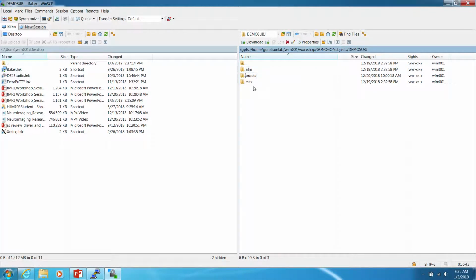Yeah, so just for a little bit more cloud level, with fMRI, the signal to noise is pretty small. So what you have to do is have lots and lots of events in order to filter out what is noise from what is signal. So with fMRI studies, you try to design a task that has lots of different psychological events happening, and then see what's happening on average in the brain across all those. So for this study, it's a real simple study where we have a go event and a don't go event. So that's basically what those are.